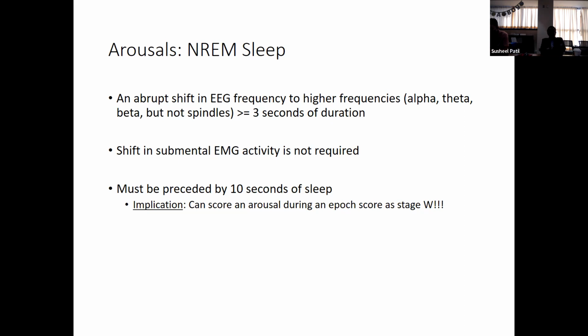So arousals, I think to some extent, are easy to define and hard to agree on. What you'll typically find is that from scorer to scorer there's a lot of variability. It's better within a person, but even within a person, if I gave you a study to score one week and then brought it to you a month later, there are still issues in identifying those same arousals. There are both areas of omission as well as commission, if you will. So it's tough. It really is tough in terms of standardizing this.